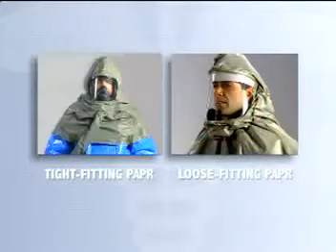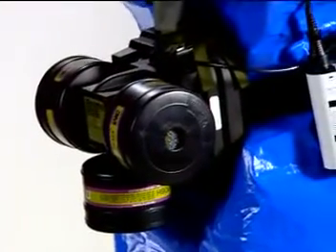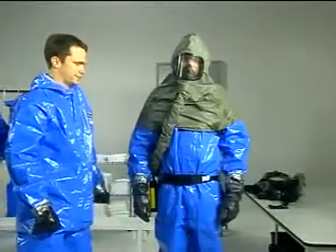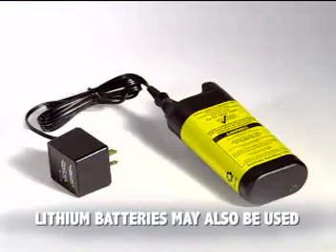The two types of PAPRs you may encounter consist of a tight-fitting full facepiece ensemble used with a protective hood, or a loose-fitting hood with integrated facepiece. The PAPR will also include a belt-mounted turbo unit with a battery pack and filter cartridges, and a breathing tube connecting the turbo unit to the facepiece. A battery charger is used to keep batteries fully charged when the respirator is stored.